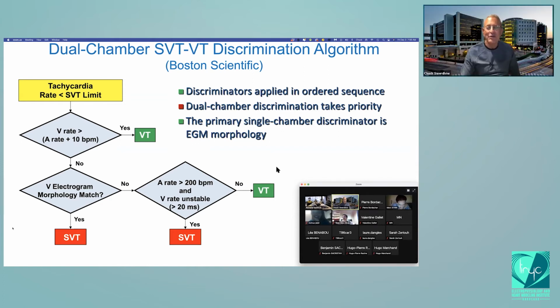Okay, good. Well, this is what we call serendipity. So we'll go through it. So the first step, though, right? The assumption is that atrial sensing is reliable, and you can see the P waves in a dual chamber defibrillator, whereas that's not your assumption on the surface ECG during wide complex tachycardias. I'm not going to spend much time on this, but you notice they don't say ventricular rate is greater than atrial rate. They say ventricular rate greater than atrial rate plus 10 beats per minute.